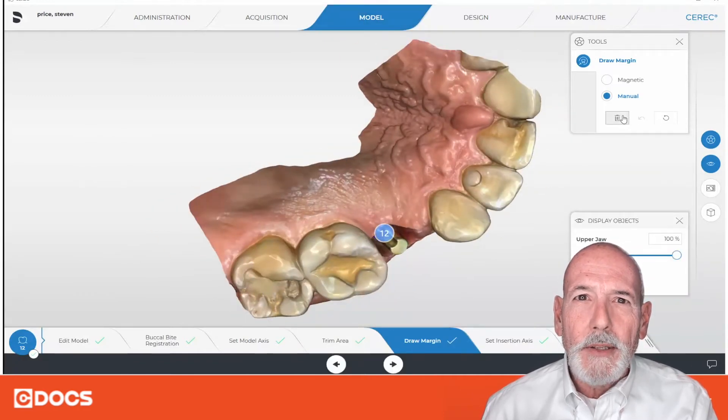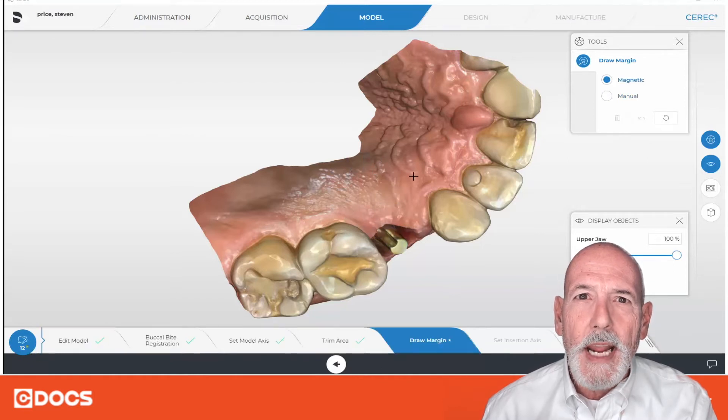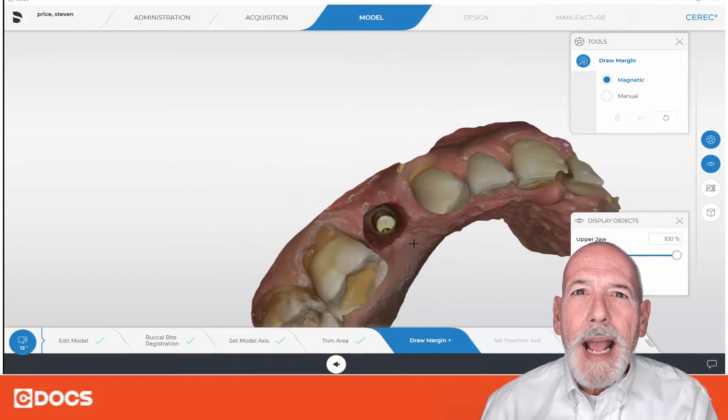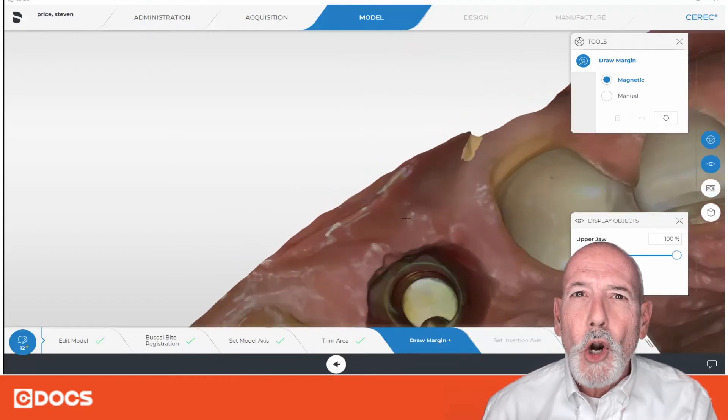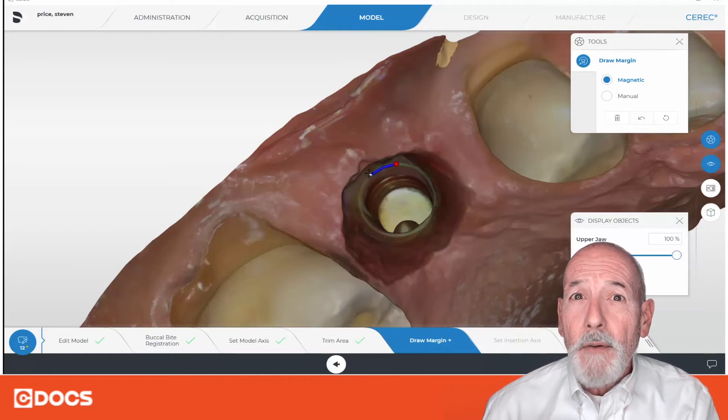All proposals are started at the margin, so I'm going to go back to this and re-marginate here. I'm going to get rid of the margin right off the bat. How I'm going to marginate is I'm going to turn the model upside down so I can get a better look at the margin of this stock abutment. When things are really deep, this just gives you a different perspective of how the margin can be drawn.